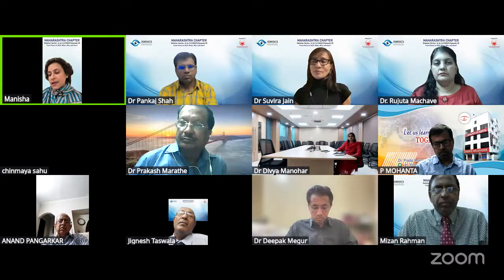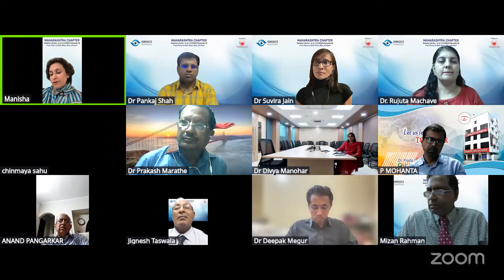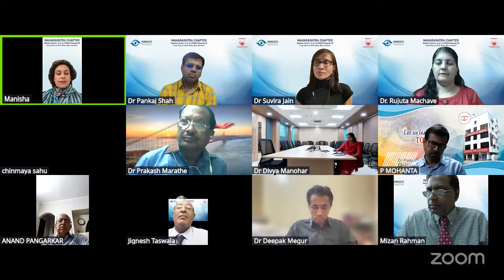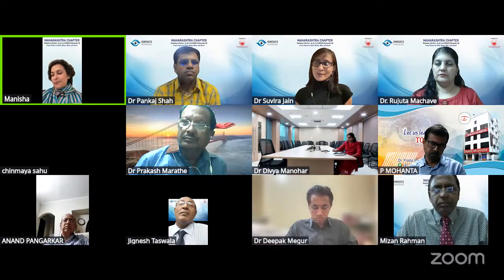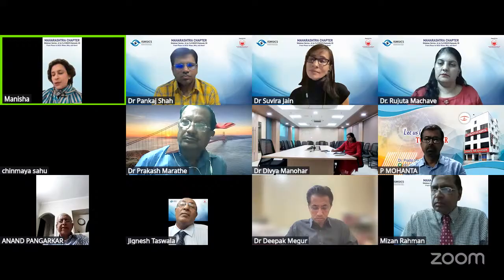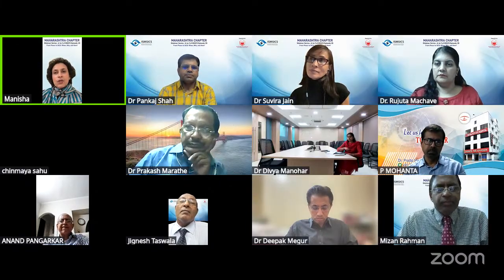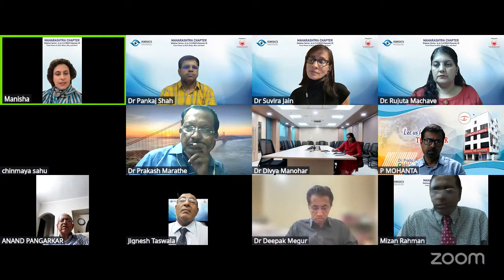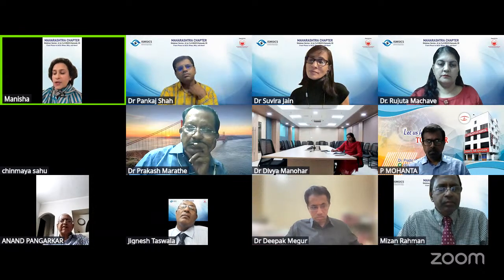So finally, it is up to the surgeon how they do it. And Dr. Suvira, case 1, 5, and 6 had beautiful tunnels. So, and 1 and 6 are yours, I know. So just extremely beautiful videos and wonderful to watch, and how coolly and calmly you've handled it, and of course expertly. The only thing is, in the sixth case, the blue dye, a very small point, could have been put under an air bubble. Sometimes we see endothelial staining with the blue dye when we use it. And of course, you have to use an adequate amount of blue dye.